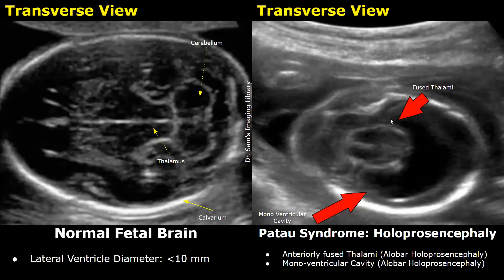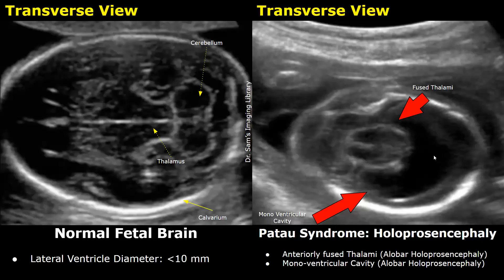On ultrasound, a normal fetal brain appears like this. This hyperechoic line is the falx cerebri, and these hypoechoic structures on either side of the falx are thalami. But in alobar holoprosencephaly, many brain structures are absent, and we will find fused thalami — anteriorly fused thalami — and a monoventricular cavity. A large, fluid-filled, C-shaped anechoic structure is present instead of normal brain tissue and normal lateral ventricles. This is a monoventricular cavity, and it is seen in holoprosencephaly.